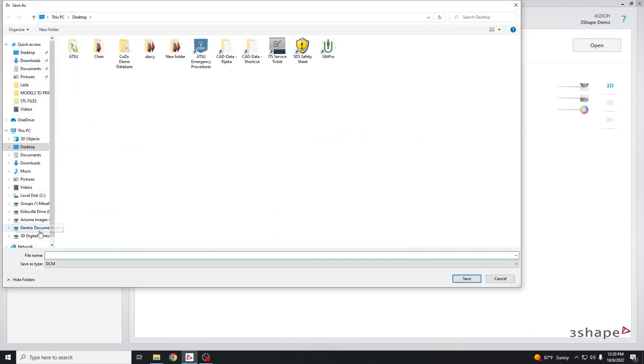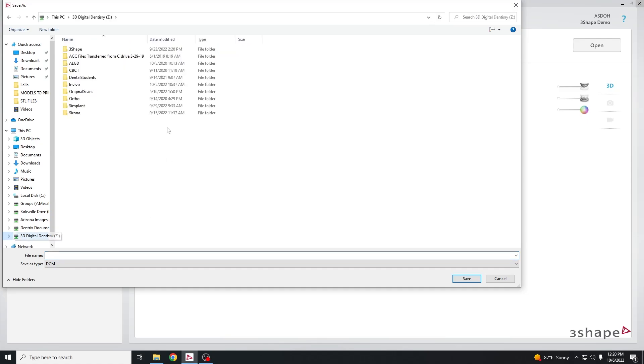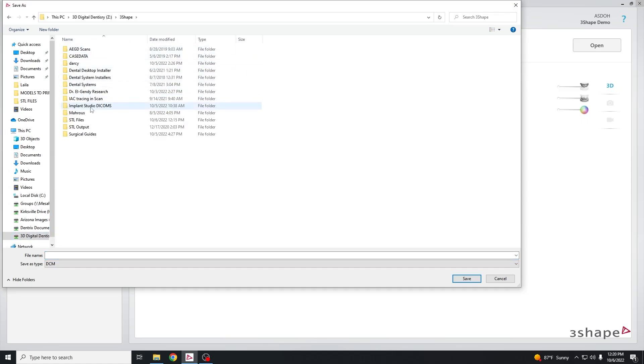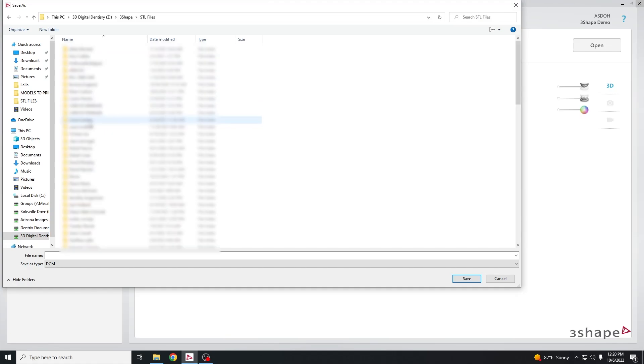Choose the Z drive and click on 3Shape STL files. This is the folder that will be saving your internal scan files to.